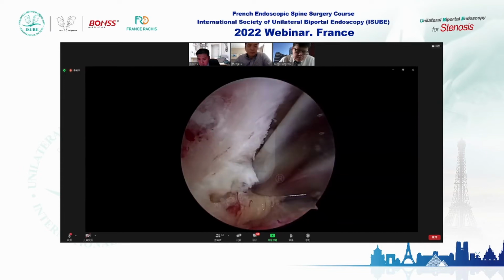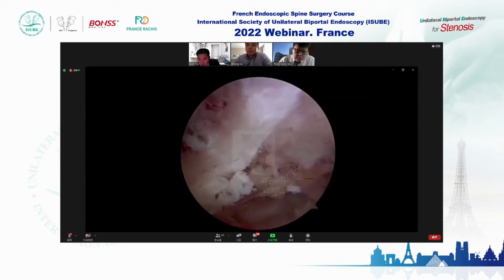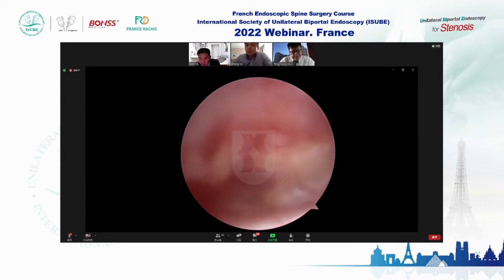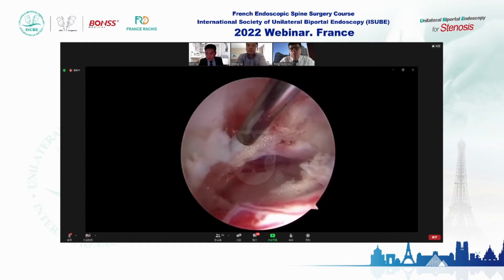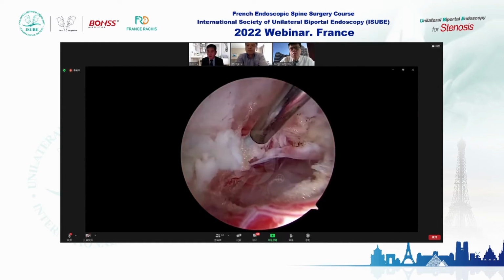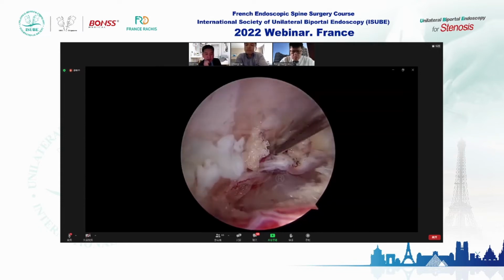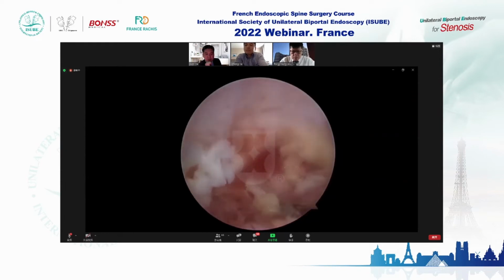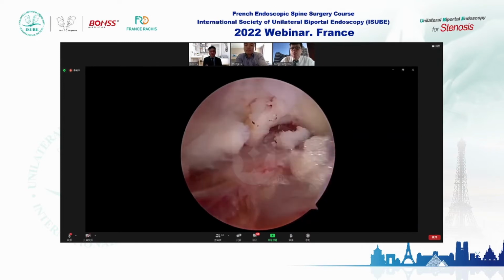So Dr. Chang's question: Any comment on the feasibility of a proper annular repair or suture after discectomy using UBE? You mean the annular fibrous suture? Yes. Maybe I will try the annular fibrous suture through the contralateral approach. But I do many cases with the ipsilateral annular fibrous suture.